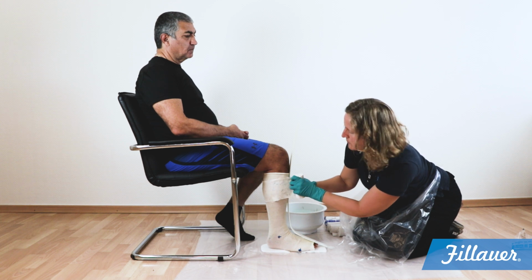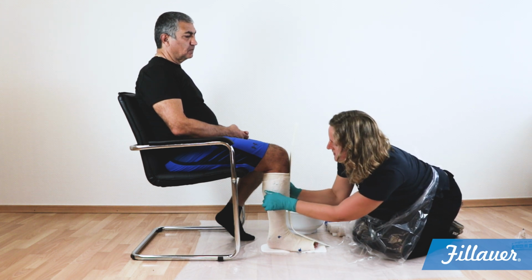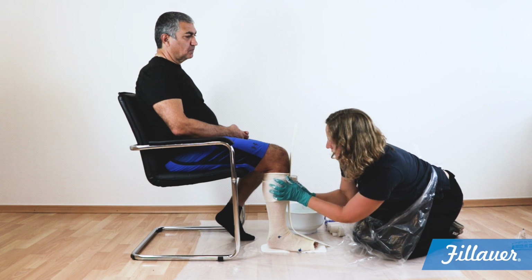Here, make sure you're above the line, about 5 centimeters above the height of the finished brace.